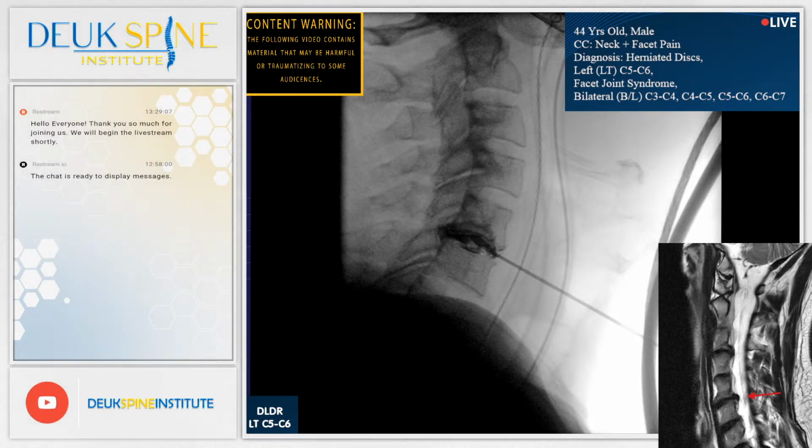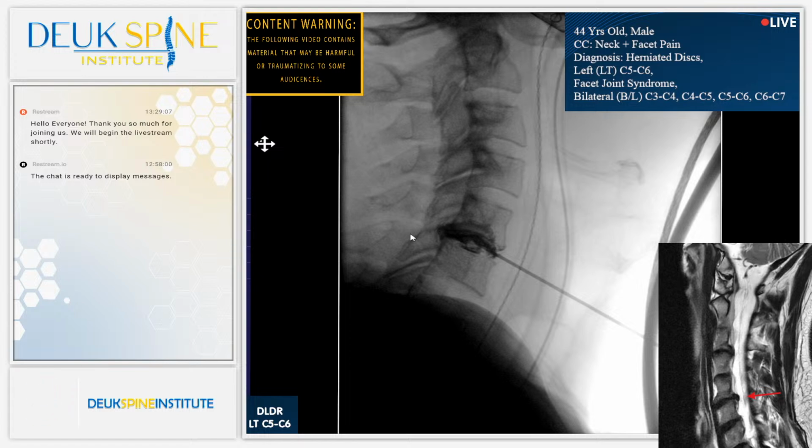Shot. All right, look at that tear. That is massive. Jordan, show us the tear. All that black, that giant black leaking out the back of the disc. Look at the herniation, folks. Put the arrow on the herniation. Right there. You guys see that bump sticking out? That is his herniation. That's where his symptoms are coming from. We're going to go remove that with the laser.